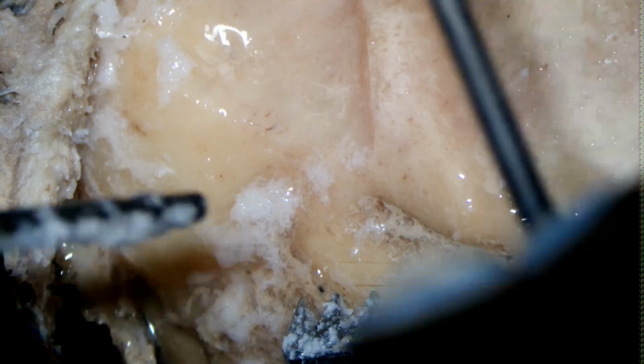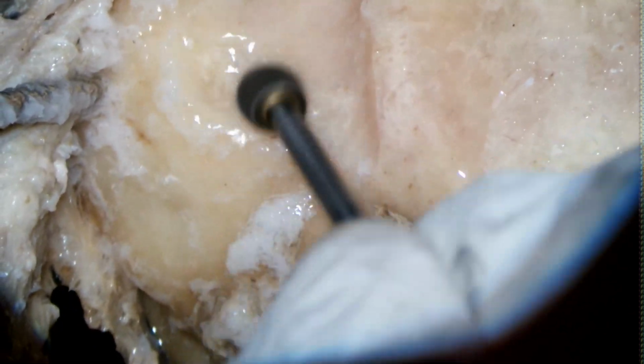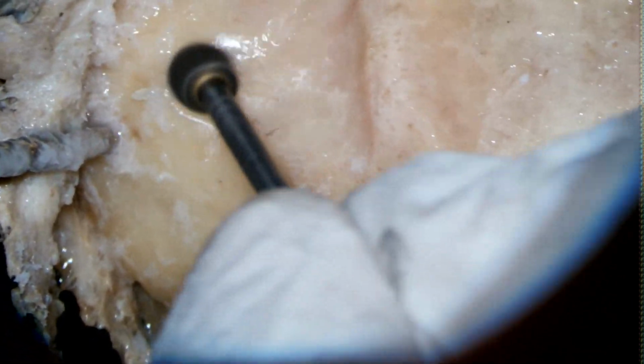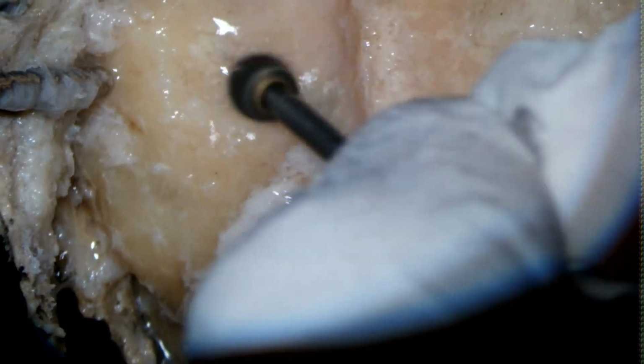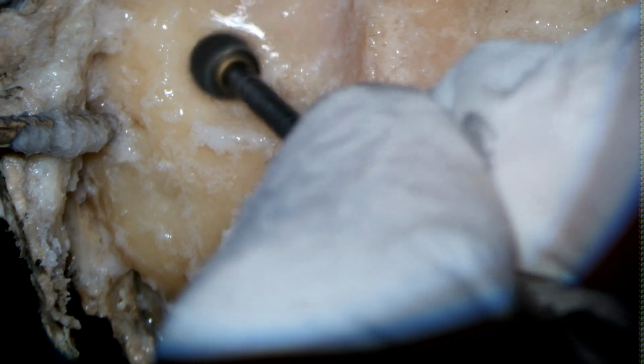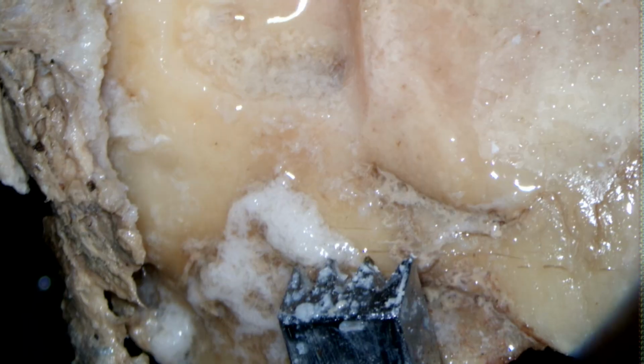And when you are drilling, you should use a larger size burr for opening the antrum. Keep on saucerizing the edges. Don't go into a pinhole.